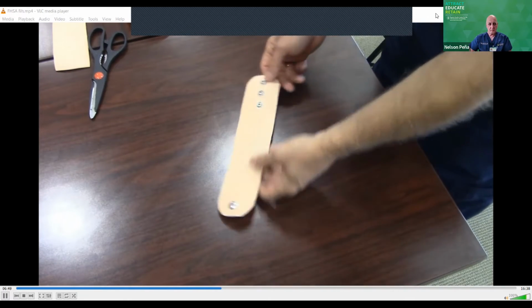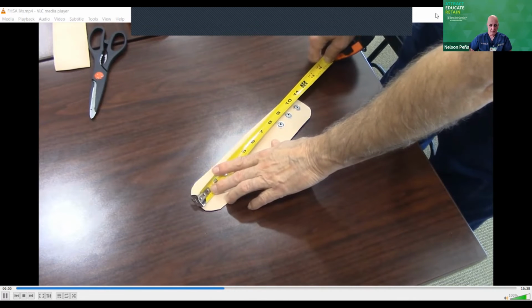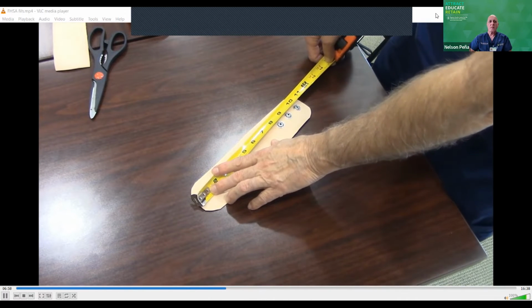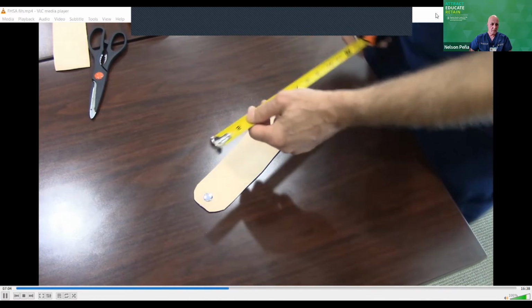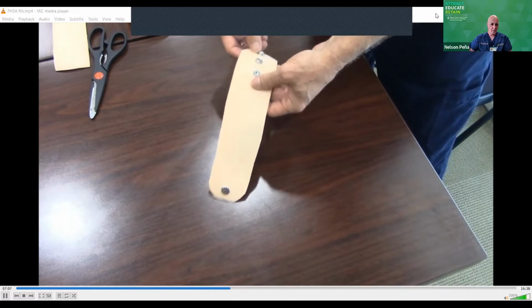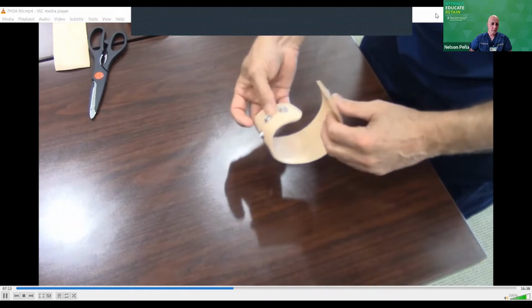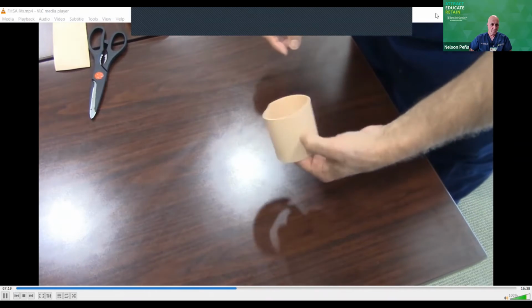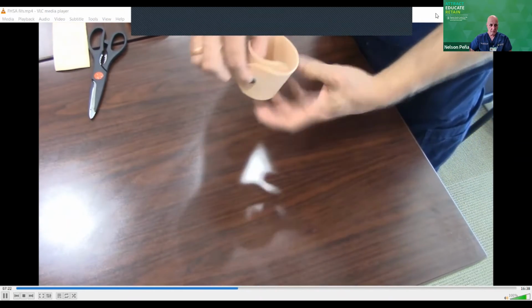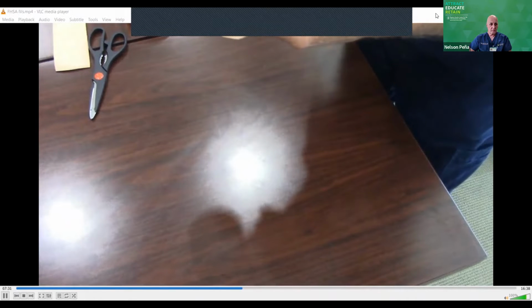Okay, now that I have my strap ready to go, just for the sake of argument, I used a piece that's about 11 inches long. Again, if you wanted to put an IV in a leg or something, you may want to make it longer. But for the wrist, 11 inches gives me more than enough. With these three little holes, it gives me about an inch and a half, 2 inches of play on each side. So I'm going to snap it to the center one, and then the hole where the IV is going to come out, I want to put just opposite of the center hole, so I would go right about here, and that's where I'm going to put the hole that I'm going to use to run the A-line through.